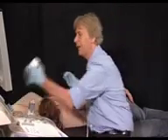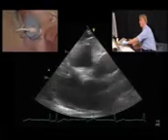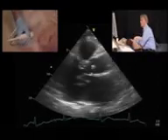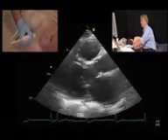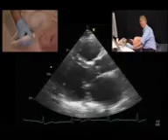It's actually quite difficult to really perform planimetry of the mitral valve, and you have to consider a few things. The first thing, always look at the parasternal long axis view first, because there you get a good appreciation for the opening motion of the mitral valve. In our patient here, we can see that the mitral valve does open quite nicely. You see the anterior and the posterior leaflet separate quite nicely, so it does not look as if stenosis is really severe.